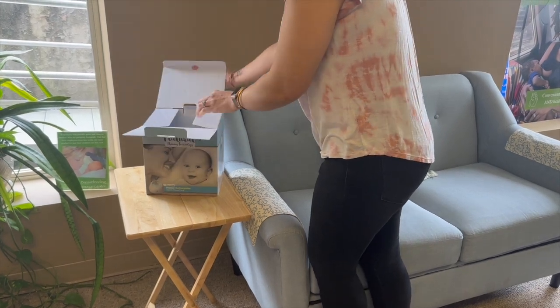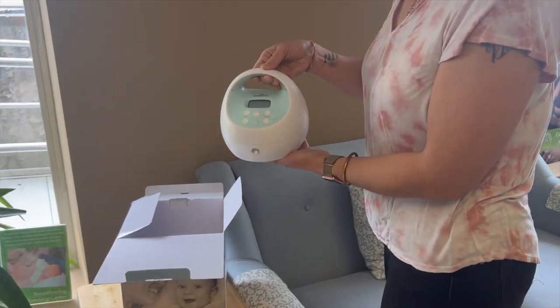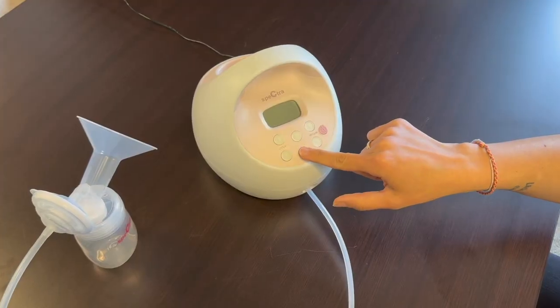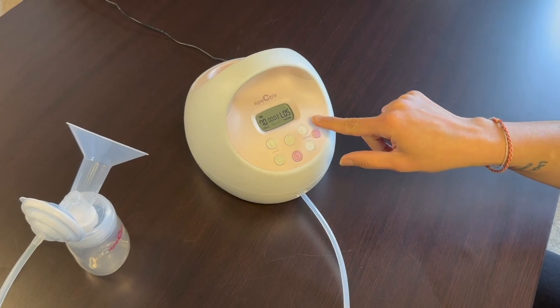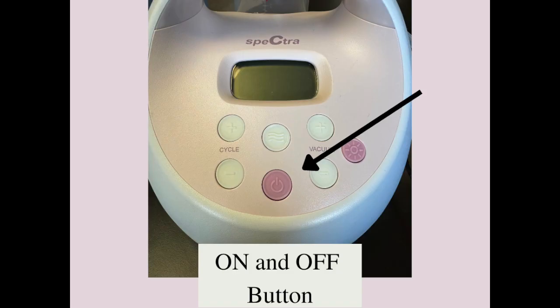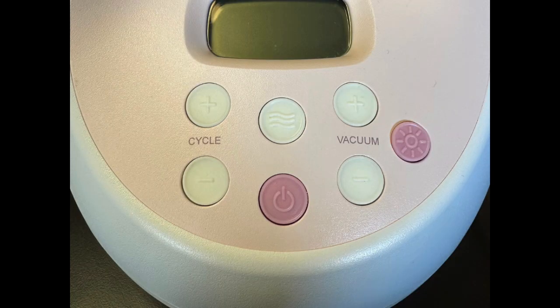Sometimes the Spectra can be overwhelming when you first take it out of the box because of all the buttons, but it's very simple. First we'll talk about the buttons on the S1 and the pink buttons on the S2. The one in the middle turns the machine on and the one on the side is your light to make pumping in the dark much easier. Then you have two white buttons on the left, two on the right, and one in the middle. The one in the middle is your let-down button and we'll get to that one in just a minute.